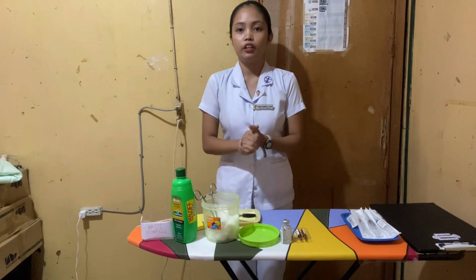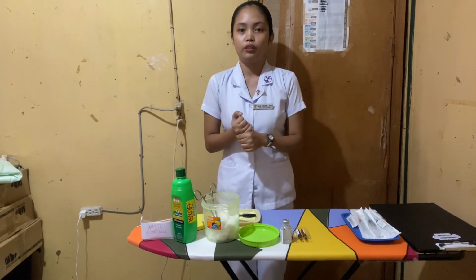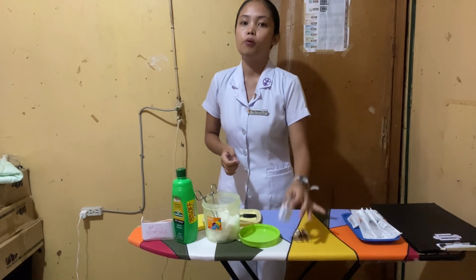If the medication still needs to be reconstituted, then the vial would contain the powdered form of the medication and a diluent must be added into that vial. After adding a diluent, we must mix it thoroughly by rubbing the vial between the palms of both hands.